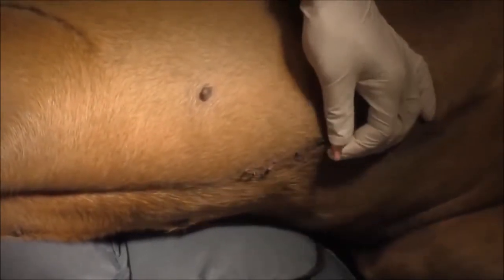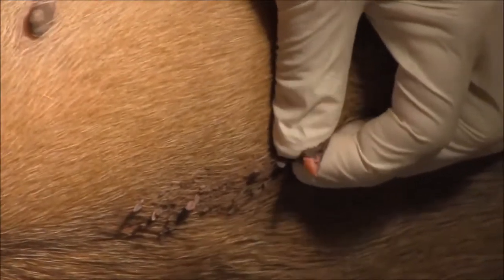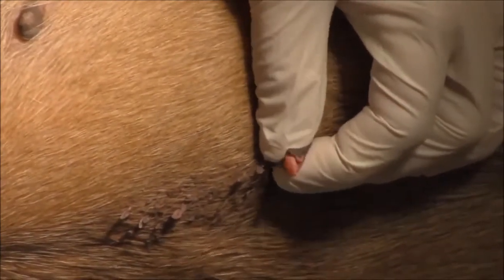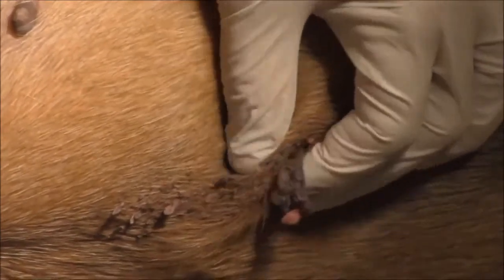Right here is Angus. Angus is about a 5-year-old bull mastiff and he gets these skin tags on his belly. You can see he's got a lot of them — I've taken them off and frozen them off and they come back repeatedly. I want to show you how this unit can help take these off quickly and efficiently, with not a lot of pain. He's barely sedated today just for this demonstration, but you can do this on dogs that are not sedated.